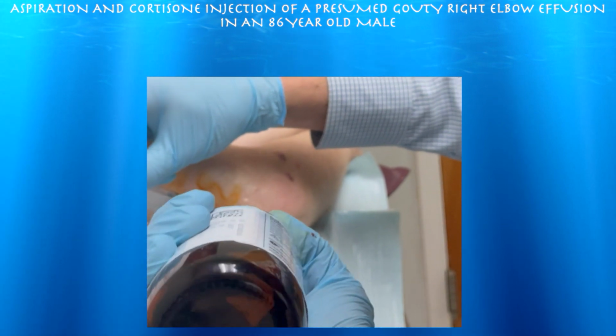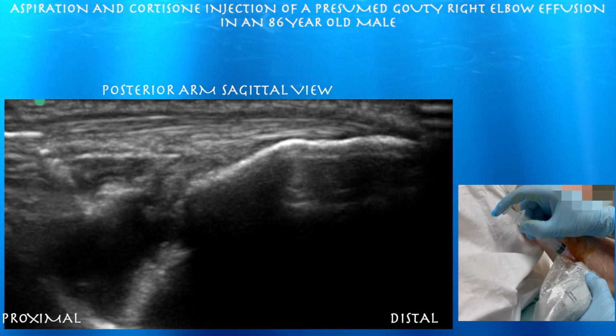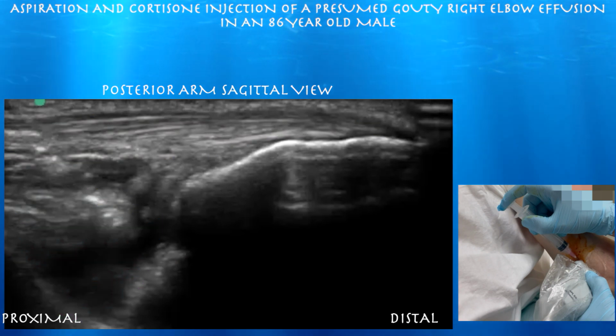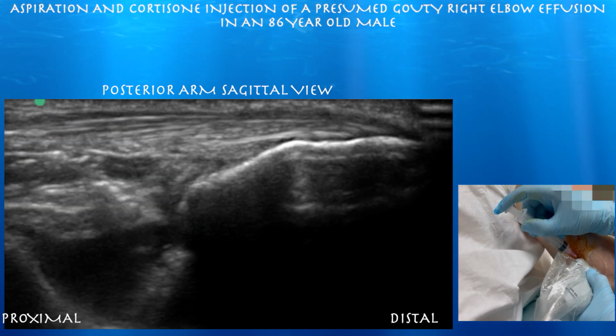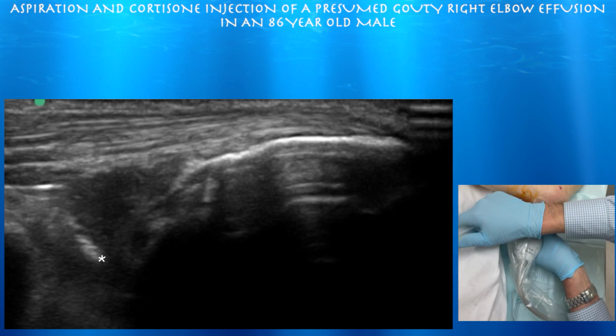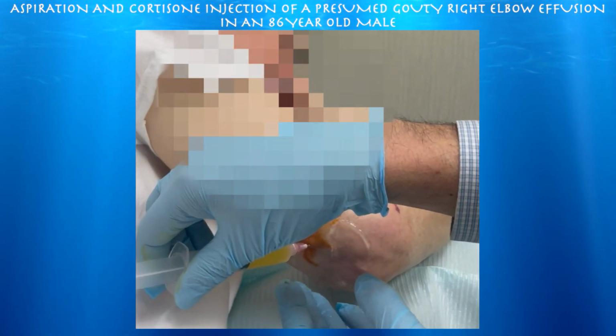Here we're starting the procedure. The probe is in a sagittal plane over the posterior elbow. It's an in-plane approach. You can see the needle going into the olecranon fossa. You can also appreciate the posterior fat pad that it initially goes through before it actually gets into the fluid. So here we're pretty deep in that fossa. You can appreciate the tip. Stay still. We got the fluid out, okay?